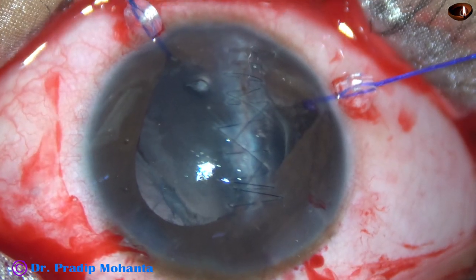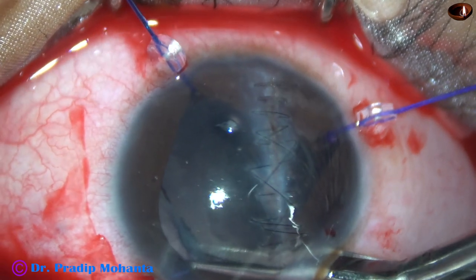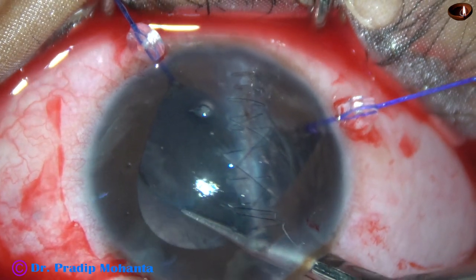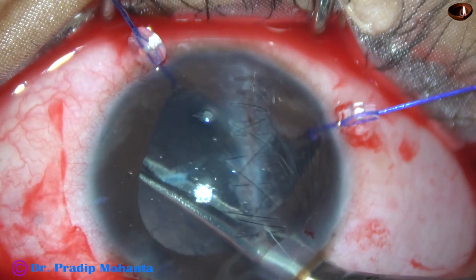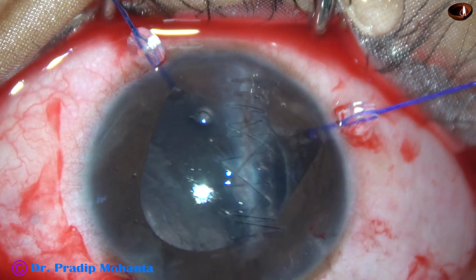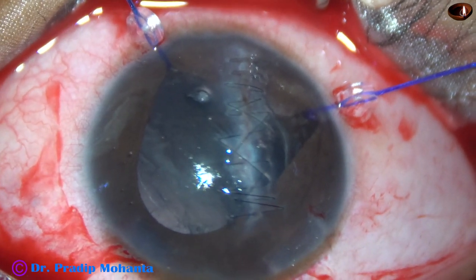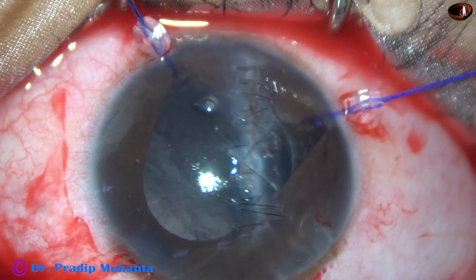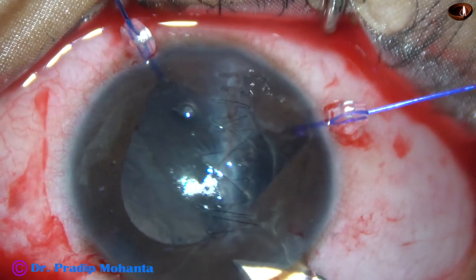The patient is 10 years old and will cooperate for a YAG laser procedure. He is cooperating for peribulbar anesthesia, so he will definitely cooperate for YAG laser. So my plan is to do an early YAG in this case after about three weeks. Now I inject visco and enlarge the main wound a little bit so that the cartridge can go in easily.